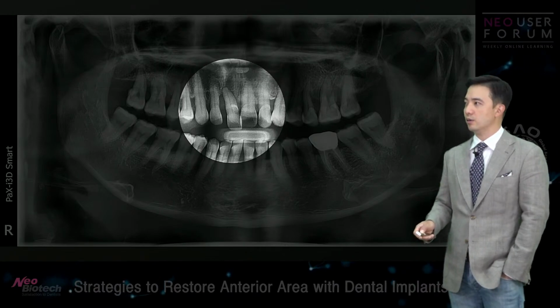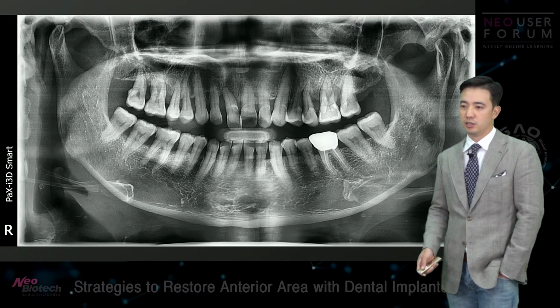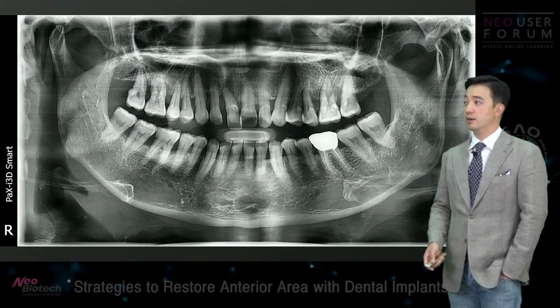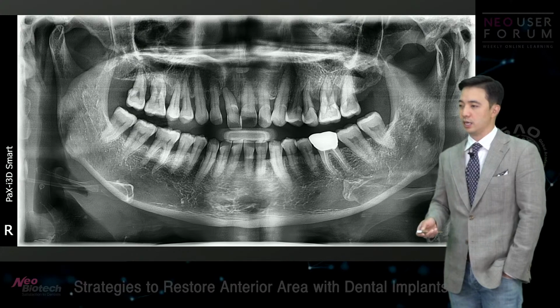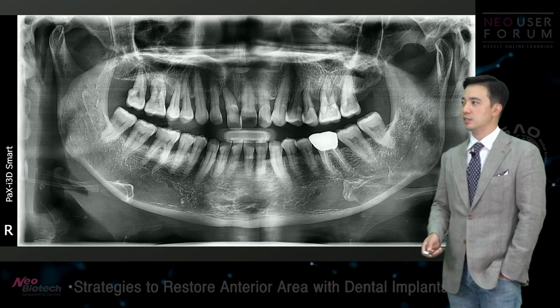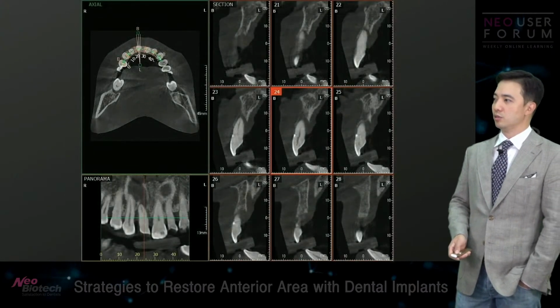It's also very low. So if you were to go ahead and place an implant in that kind of condition, you'll end up having a really, really long clinical crown with the recession. So it's going to look bad for sure. So I just didn't want that. And after having those kind of experiences with massive GBRs and all that, I just wanted to avoid those kind of situations.